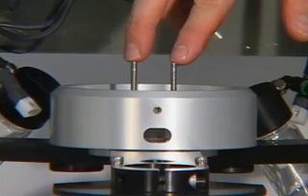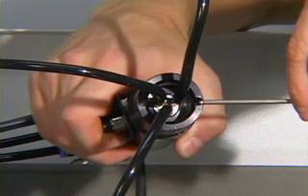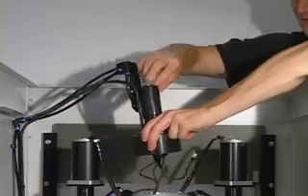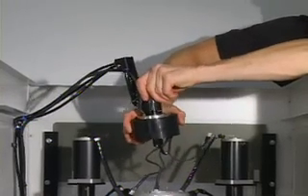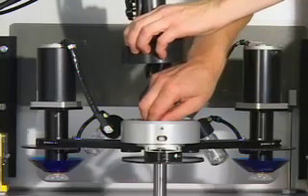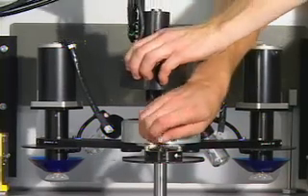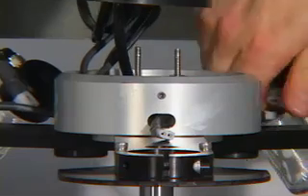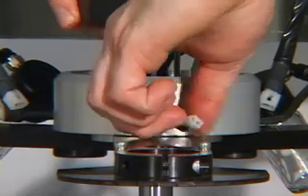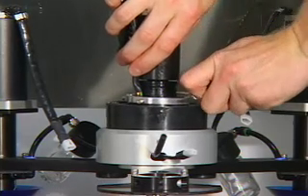Note, the two holes on the bottom of the rotary union need to slide over studs in swing arm hub. Place rotary union in brush block. Place labeled tubing and cords in appropriate holes in the hub. Rotate the bottom part of the rotary union until the holes slide over the studs in the hub.